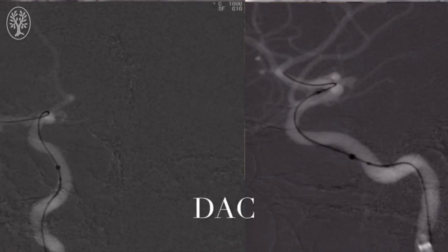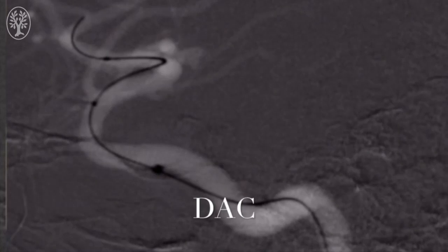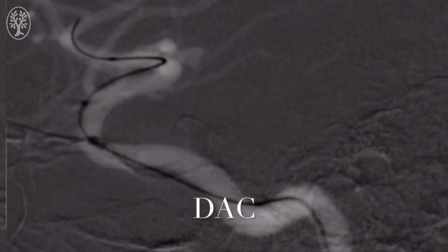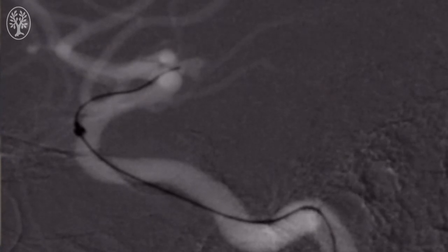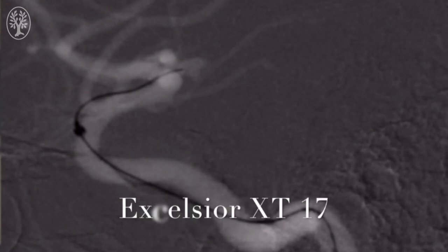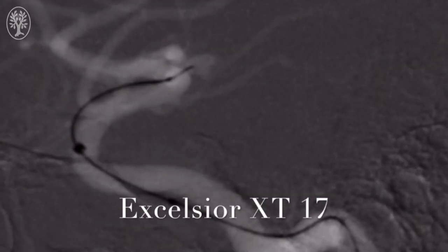We like to navigate the wire distal to the aneurysm to prevent any inadvertent perforation as we bring up the triaxial system. Once we're past the aneurysm, we're going to pull back the system, and the wire often clicks into the aneurysm. Once the wire is in the neck of the aneurysm, we'll then bring the microcatheter up under direct visualization, under high magnification technique.